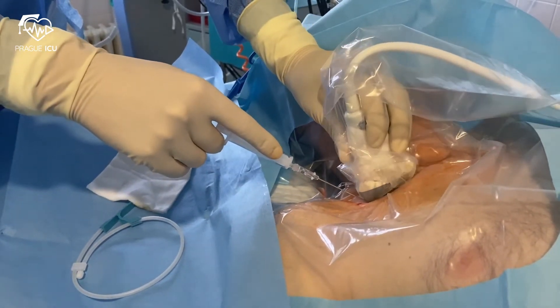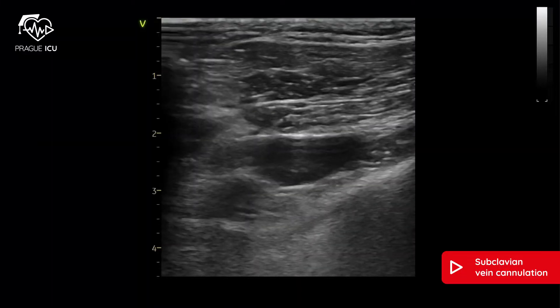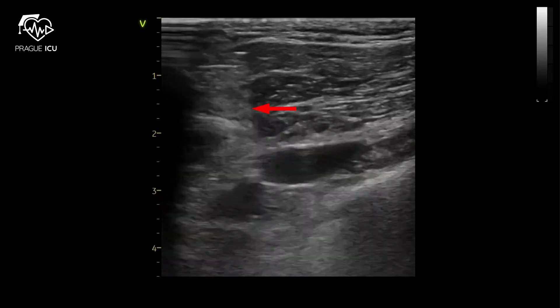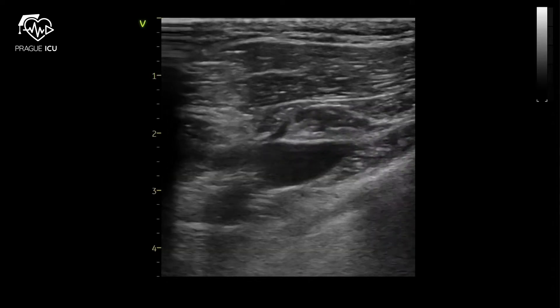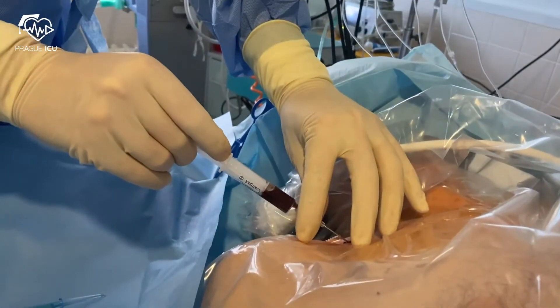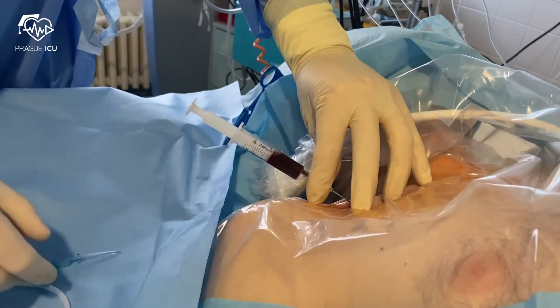Approach the introducer needle at an angle of approximately 30 to 45 degrees. The image of the needle tip needs to be followed at all times — tilting and shifting of the probe helps with optimization of the needle tip. Now you can see the needle tip approaching the vein. The tip enters the subclavian vein while dark venous blood is aspirated.